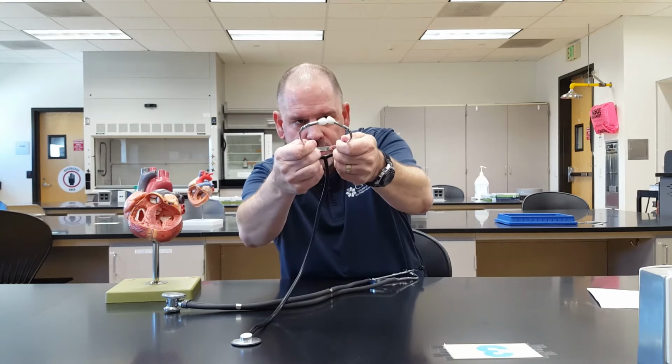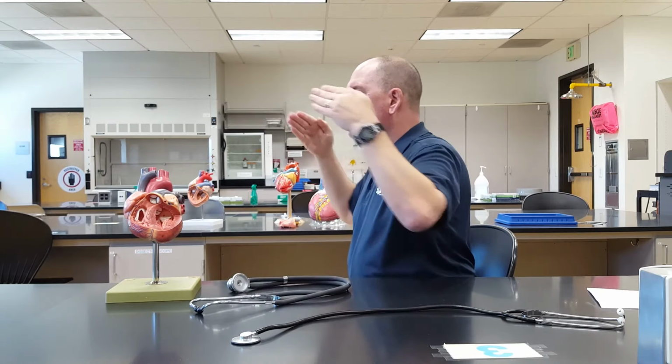The other thing that people wonder about is, how do you actually wear this thing? So I want you to look closely at these two stethoscopes, and I want you to see how the earpieces meet at an angle. They typically do that. See that? What you want to do is set your stethoscope up so that the angle is pointing forward, or that it points the same way your nose does, just like the bridge of your nose, so that the two earpieces are pointing forward into your ear canals. That tends to give you the best sound.